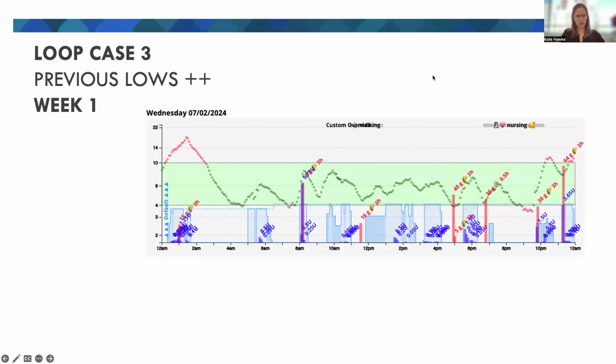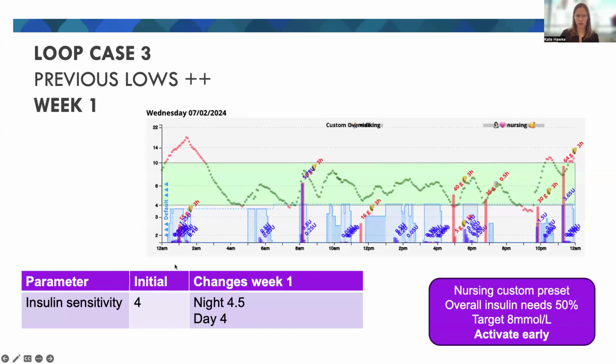And if we check out an individual day, we're seeing we still have this pattern of snacking overnight, bolus is probably a bit late, and there are all of these auto corrections from the system around this time trying to correct, and they're still a bit too strong because we're brought right down to 4 here, and this is with over 3 hours of complete basal suspend having been required to avert this low. So these corrections look pretty strong still.